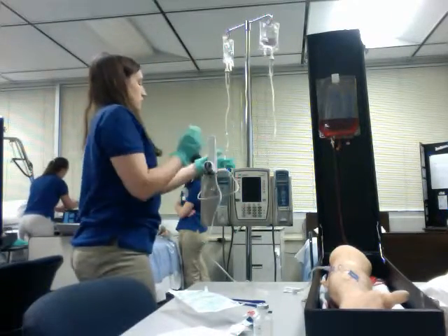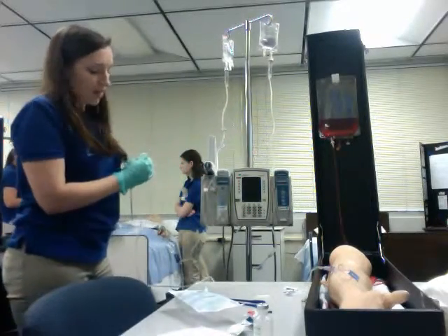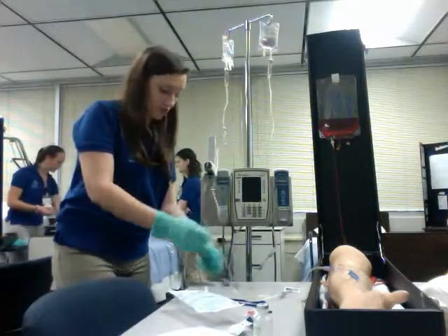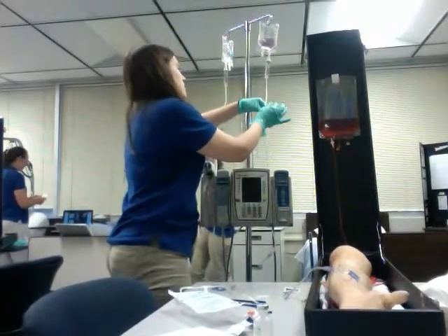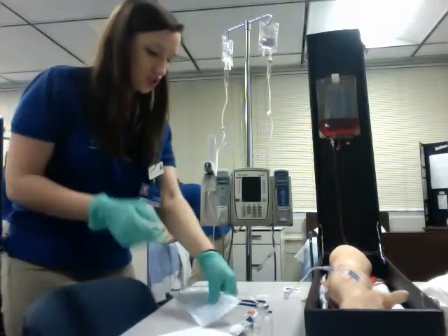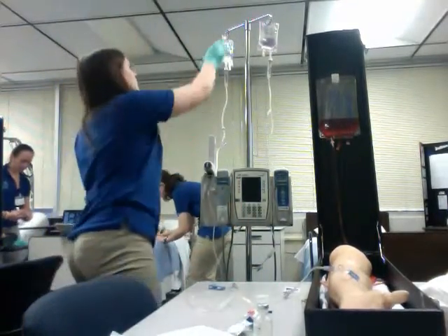Alright, so now I'm going to go ahead and clamp off my primary line. Okay, I can go ahead. So I'm going to apply the tubing label, which has the drug name, dose, my initials, and the date and time of the administration. I'm going to go ahead and lower the primary line.